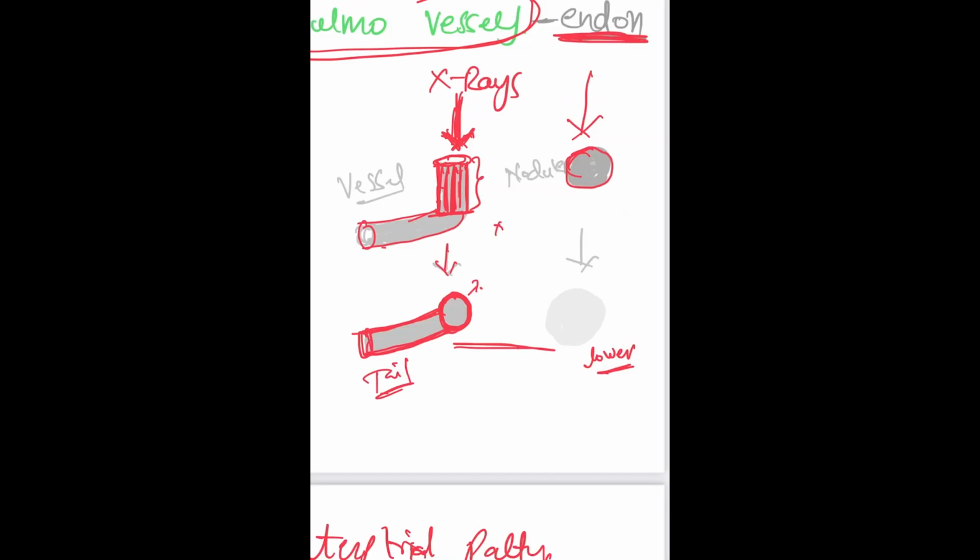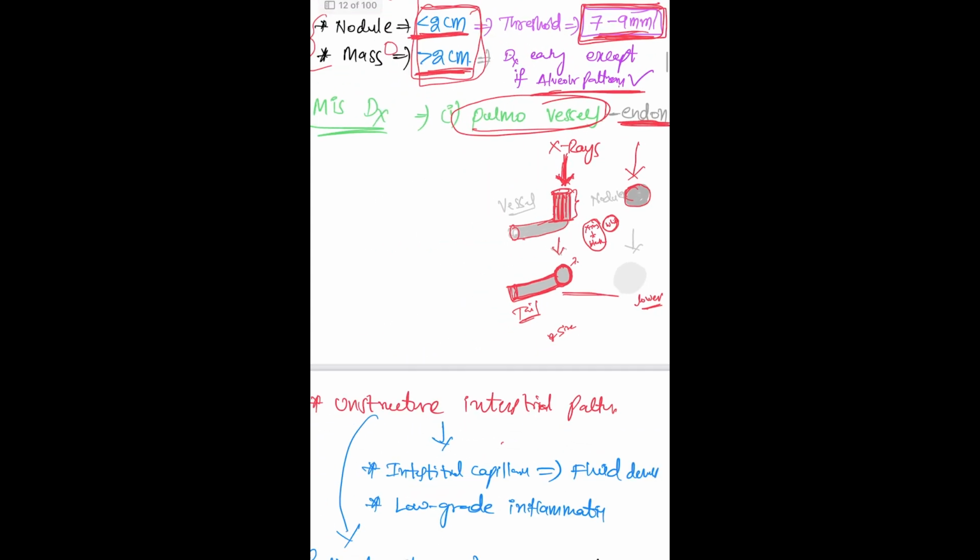If the X-ray reaches the film, it will appear black. If no X-rays come to the film, it will appear white. That is a basic thing with the X-ray and how things appear on the film. So that is the reason why you have to look at the opacity, the size, and also the tail if you want to differentiate the normal pulmonary vessel from the nodule.